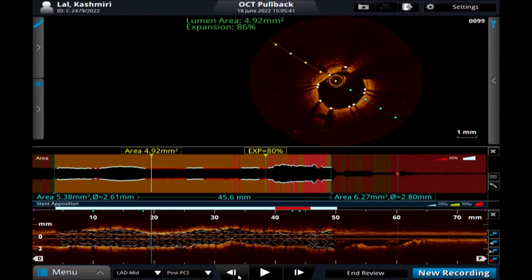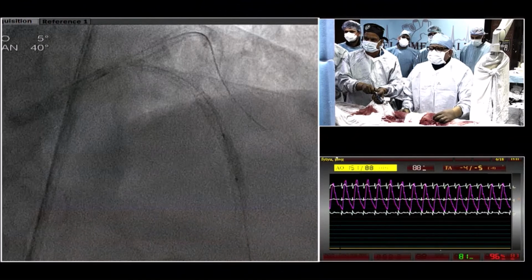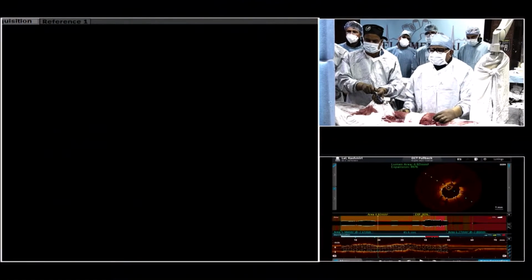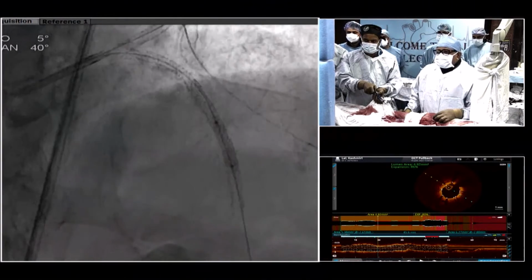Now, how you would get this, you have to decide whether you go for an NC balloon or an OPN balloon. It certainly needs much more expansion than angiographically. Well, it is an okay result, but you can't call it the ideal result. So you have to plan out strategies beyond this now.